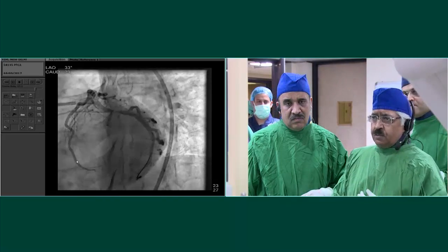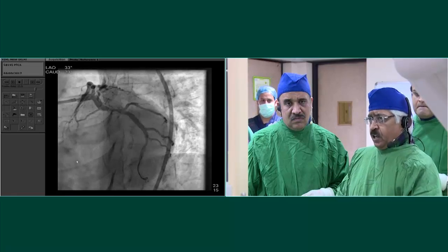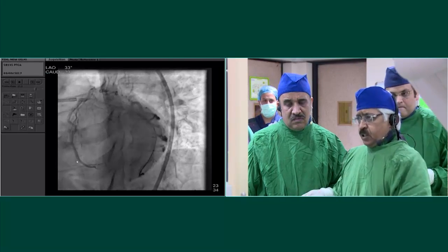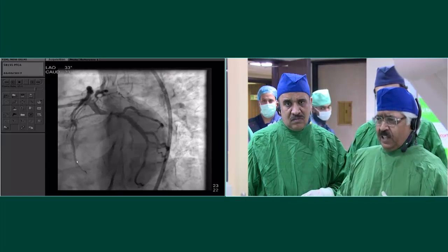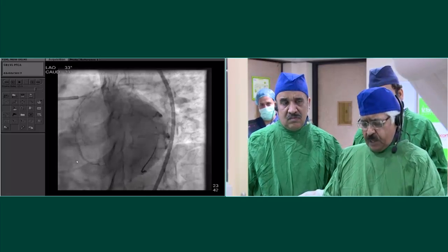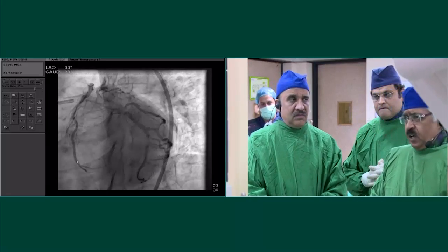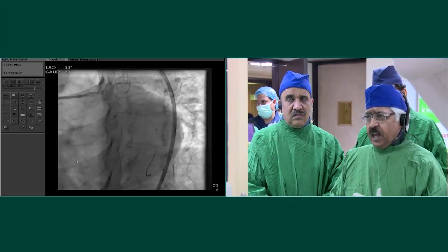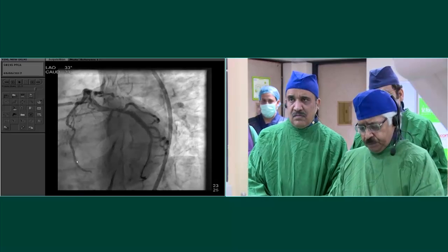I must say, despite the FFR, and I did the FFR on the LAD and I did it on the circumflex, I didn't expect it to be negative. But does anybody feel that we should anyway treat it because he's a young person with a possibility of plaque rupture and all that happening in the subsequent events? Should we just scaffold it? After all, we're using a scaffold. Does anybody feel that?